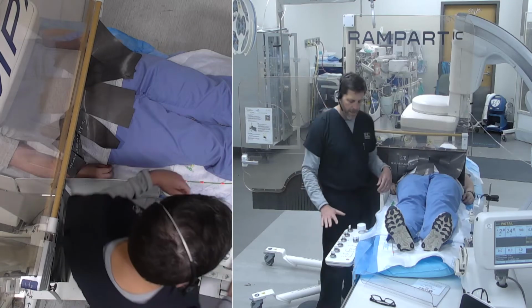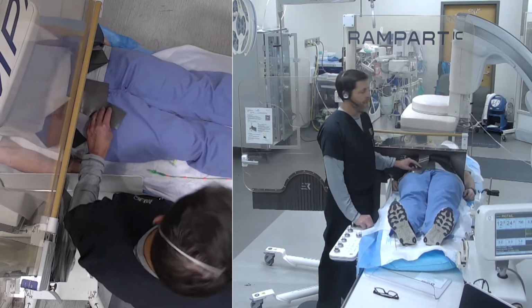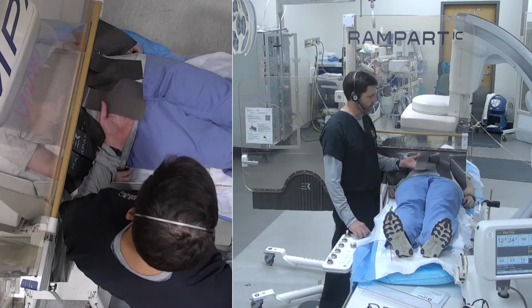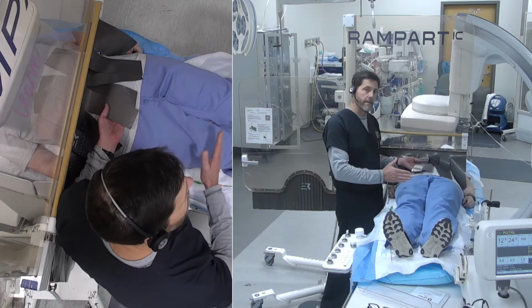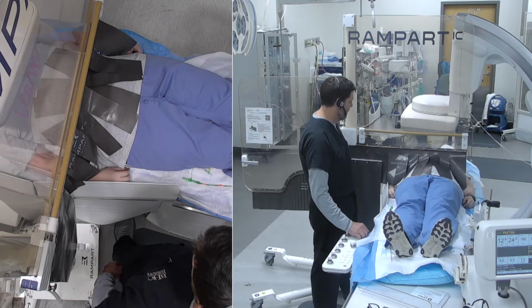Keep in mind that you have access to your controls, and so getting your access and moving the patient in and out should be very simple for you, because the lower extremity panel soft shielding can drag the sheath out. I always secure my sheaths, and so that is an important portion.